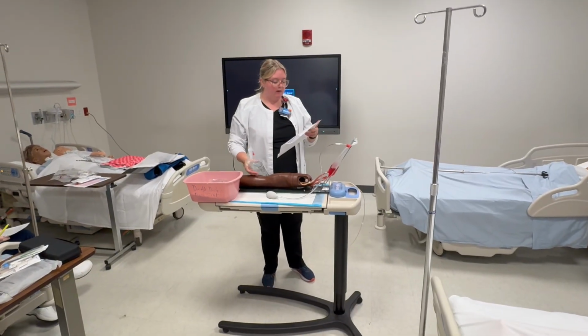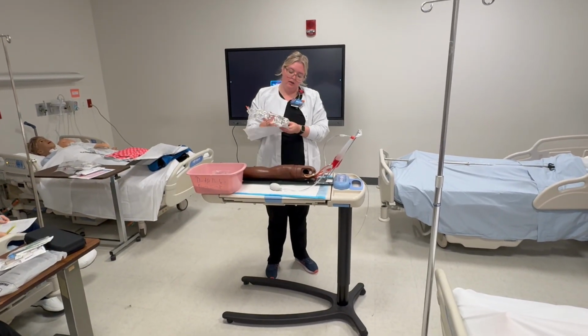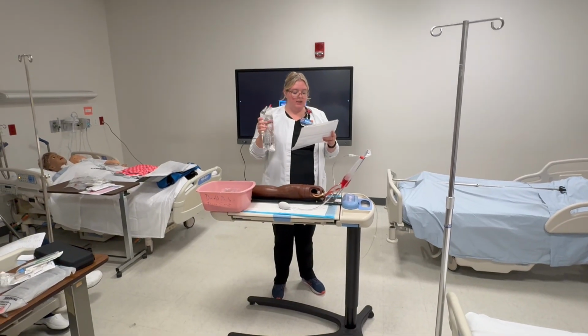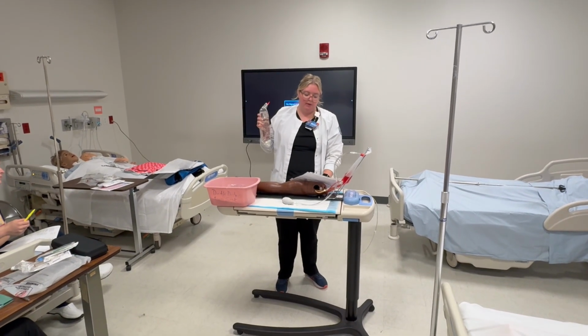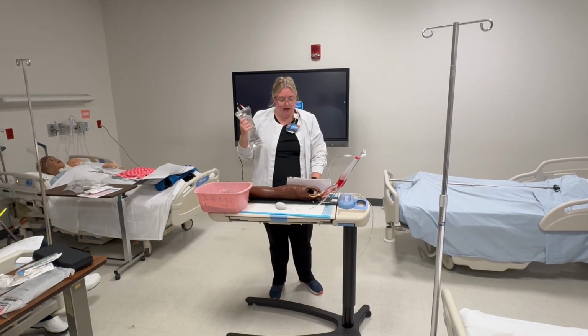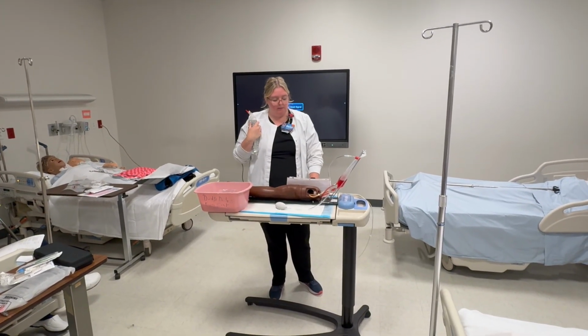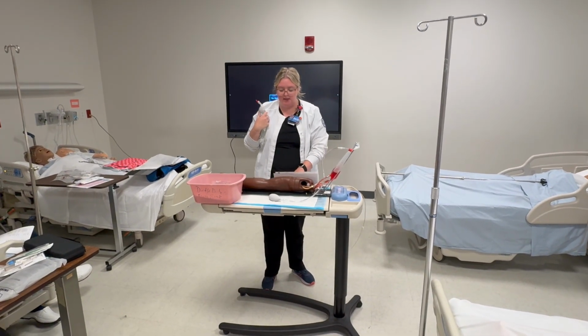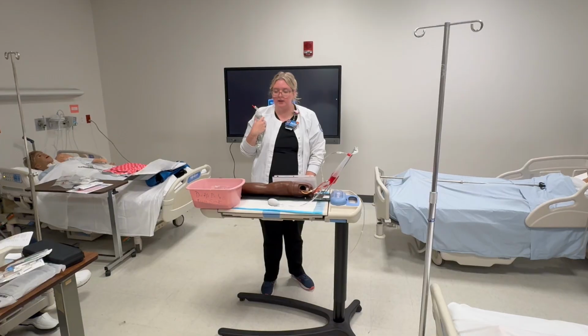My right patient, my right medication, normal saline. My right dose, I'm giving 1,000. This is a 1,000 ml bag. I'm giving it the correct route, IV. This is an IV bag. It's at the right time, which is now, and my reason is my patient has sepsis and needs fluid replacement.